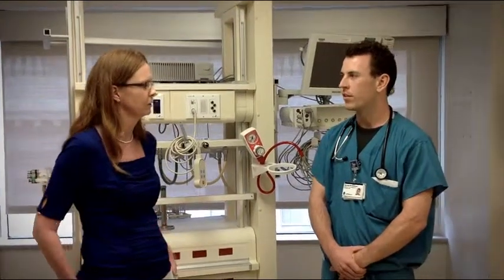So basically you really just have to look at the patient too, because all these numbers in isolation don't really mean anything. Exactly. You always want to look at the patient. As the parameter name states, rapid shallow breathing. So if someone is taking small breaths, breathing at 35 times a minute, then the number is going to be really high, and they're obviously not ready to be extubated yet. But if they're taking full breaths, breathing 12 times a minute, then the RSBI is going to be real low, and they're going to probably fly.